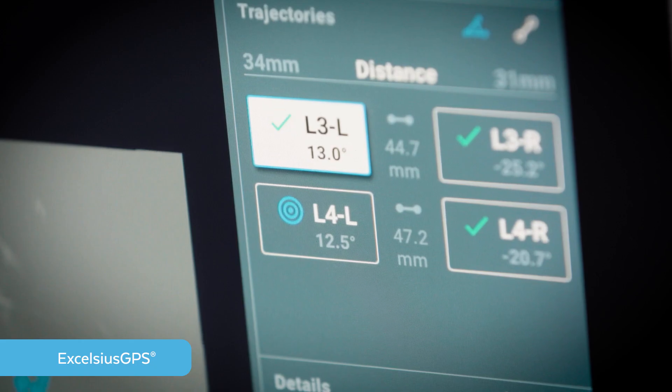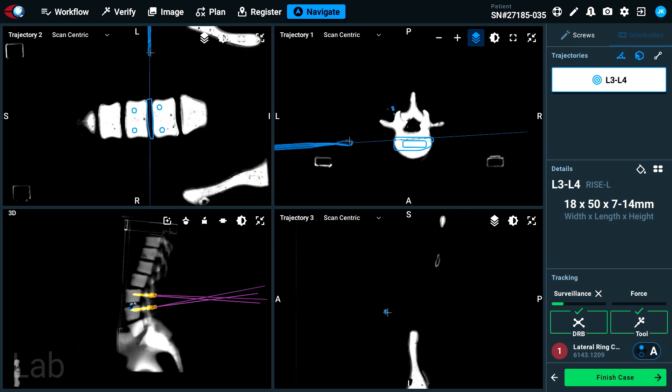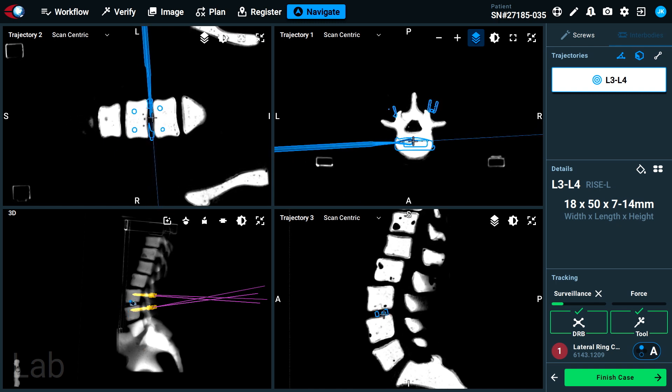It provides visual confirmation during disc preparation and interbody placement to ensure accurate alignment to the surgeon's selected trajectory. There are a lot of different acting forces during this procedure, and Excelsius GPS provides constant real-time feedback on instrument and patient shift.